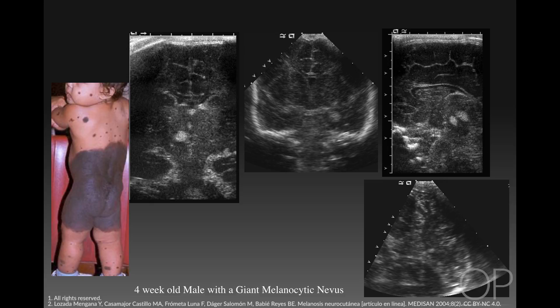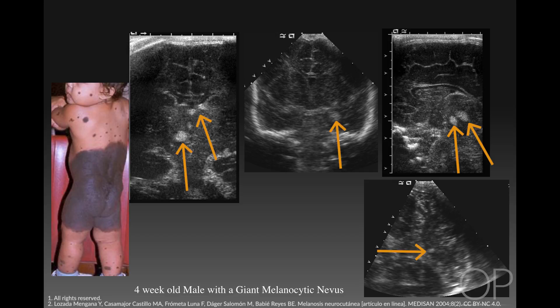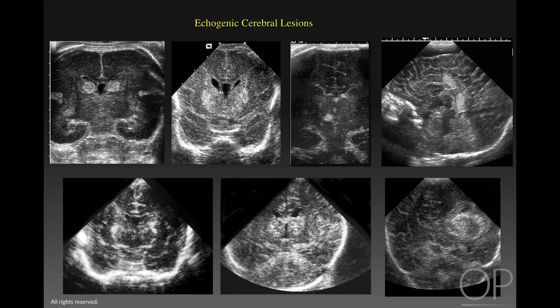And finally, we have a child with a giant melanocytic nevus in a bathing suit distribution. These infants may have congenital melanocytic or neurocutaneous melanosis in between 2% and 45% of patients. If this is a neurocutaneous melanosis, they may develop melanocytic tumors in the leptomeninges. A small percentage will have the nevus degenerate into melanoma. In this child, we have multiple focal echogenic lesions throughout the posterior fossa and midbrain that were thought to represent neurocutaneous melanosis.